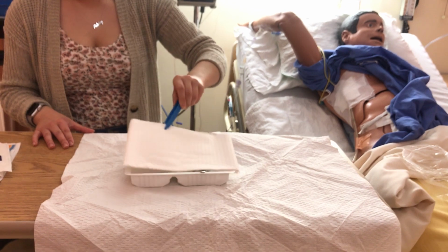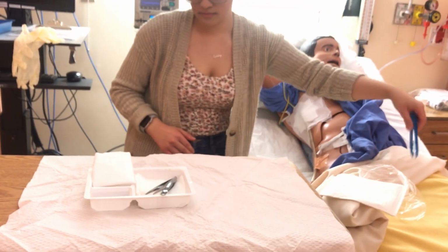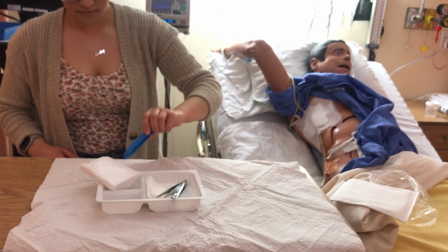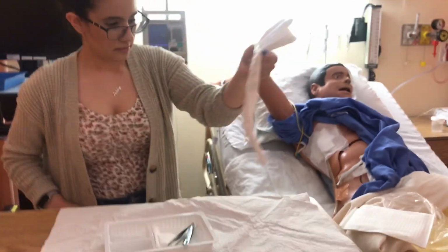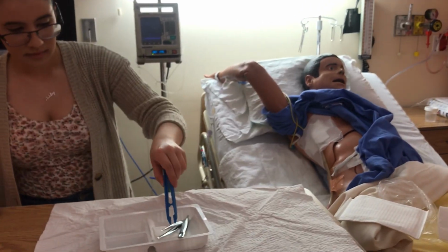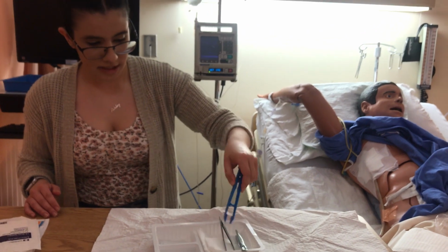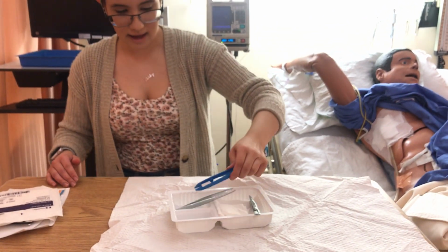I underestimated how many gloves I needed. Okay, you guys, we were missing a cap. Okay, so that's fine. And then I'm going to be using no-touch sterile technique. So just tip to tip, get these out of here.